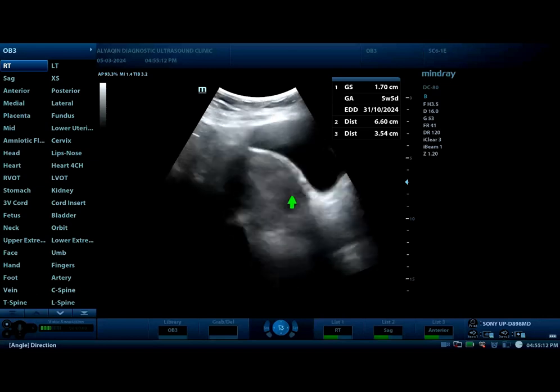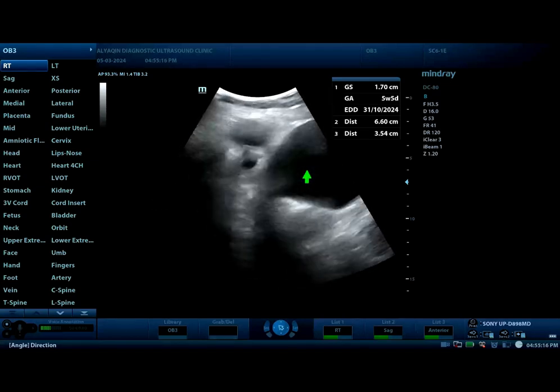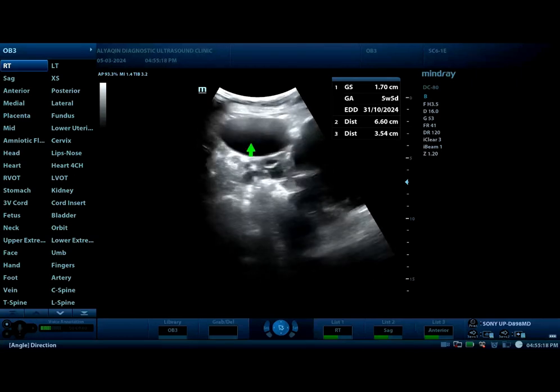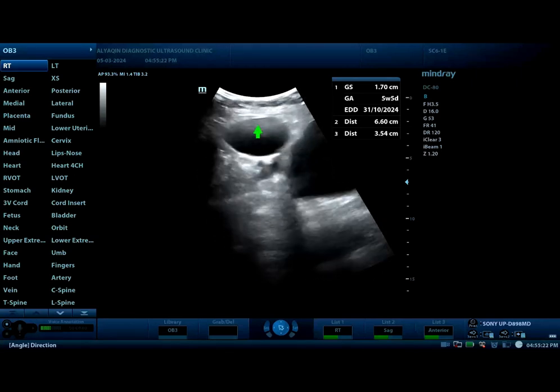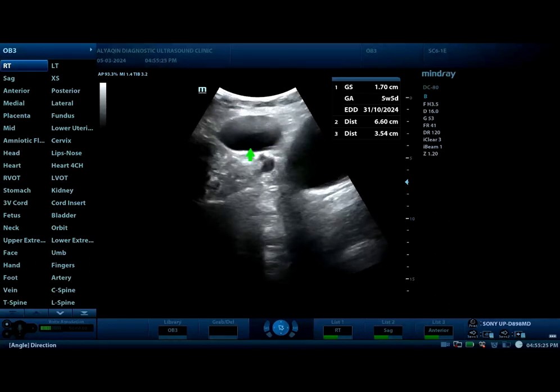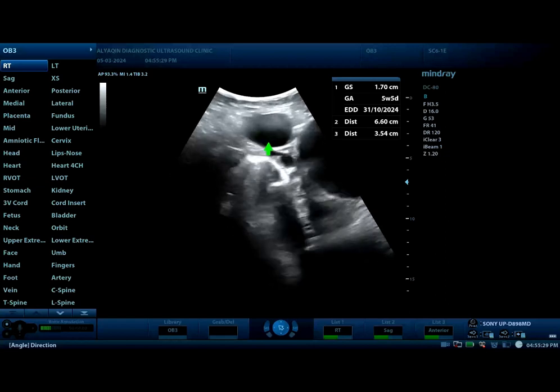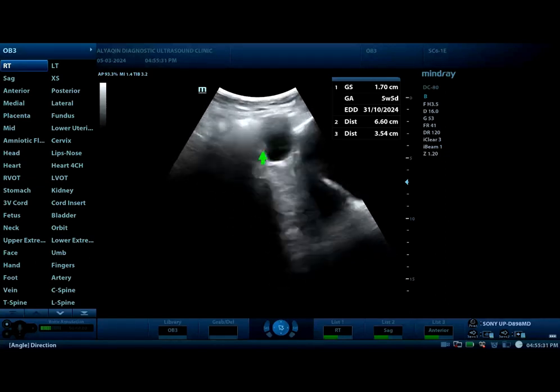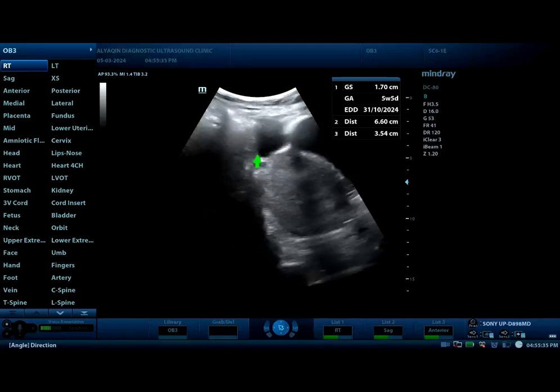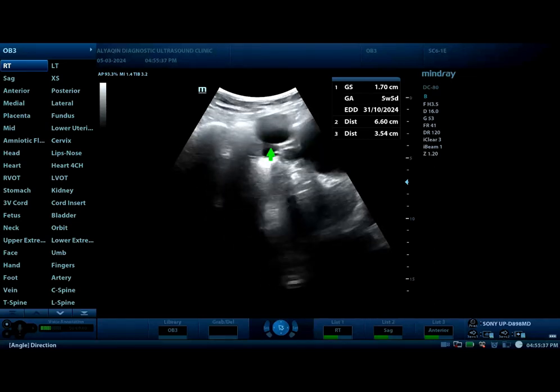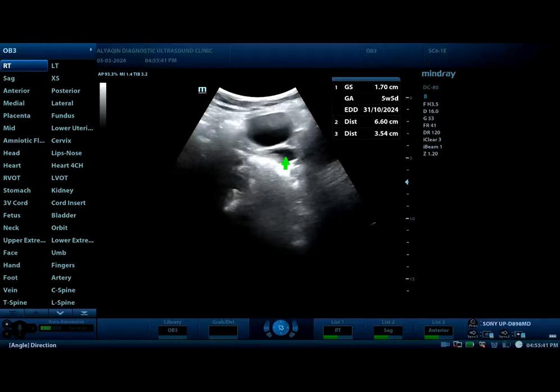The bladder is visible here. When we tilt the probe toward the right, a cystic mass appears — hypoechoic with clear fluid. The mass is oval in shape, but with manipulation you can see the mass is related to another tubular-shaped structure, and there is communication between them.